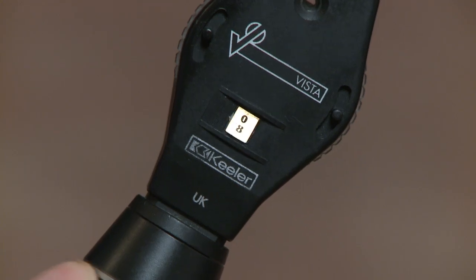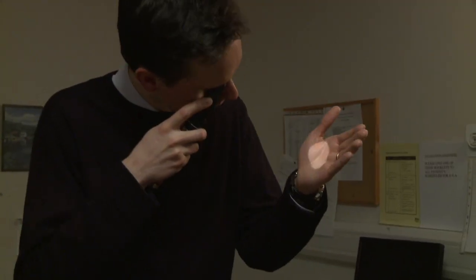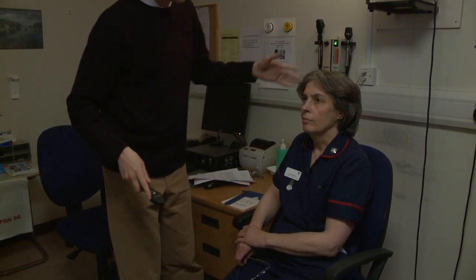Dial up a plus 8 dioptre lens which should allow you to focus on your hand at 12cm. Explain to the patient what you are planning to do and that you are going to get quite close in order to get a good view. Use the ophthalmoscope with your right hand to examine the patient's right eye and vice versa, and place your thumb of the other hand lightly on the patient's brow to avoid bumping heads.